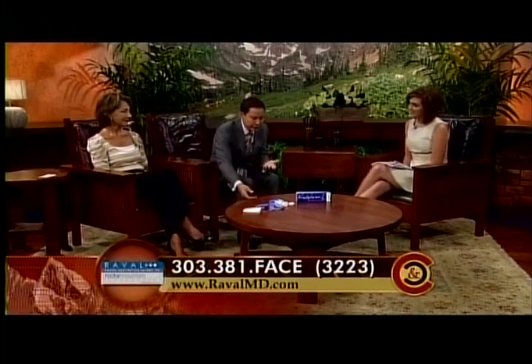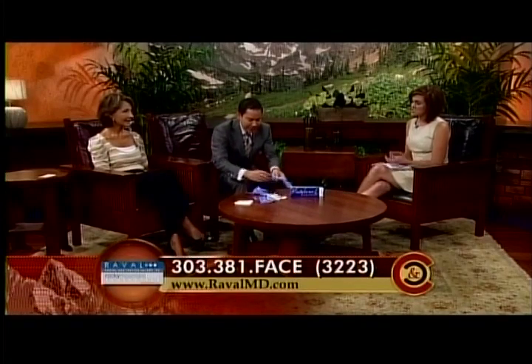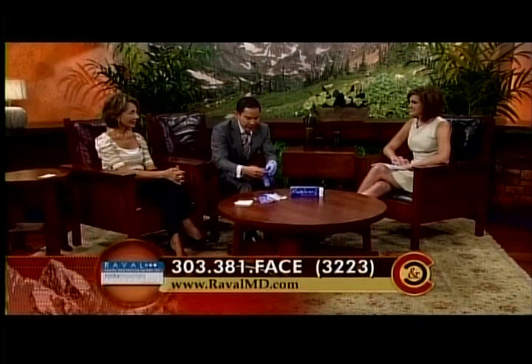You're going to actually show us a demonstration on Carol today. We're going to, so first of all, I'm actually going to demonstrate how we do this. I'm going to actually slide this coffee table this way. And so you're going to mix the lidocaine with the Restylane. Right. And this is Carol, by the way. I'm sorry to introduce you. And she's been gracious enough to volunteer to let me do the treatment on her today.